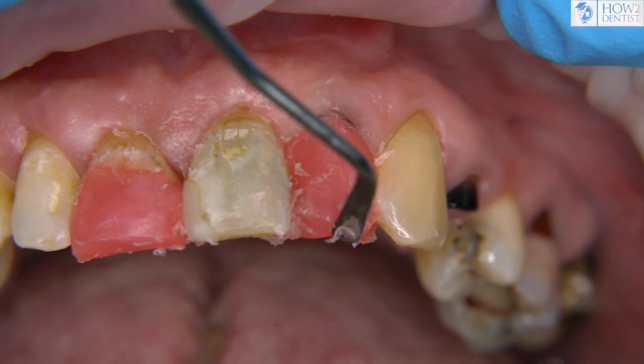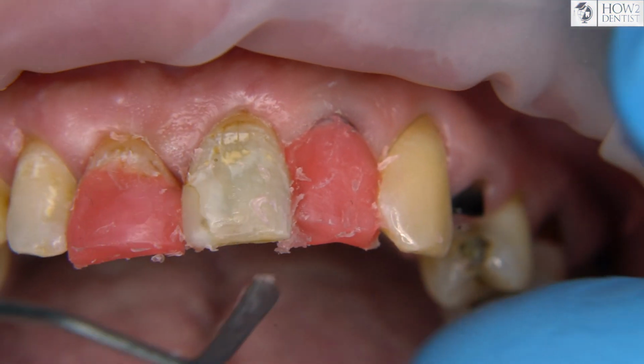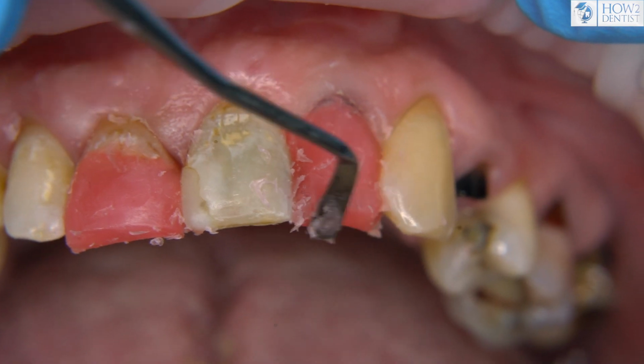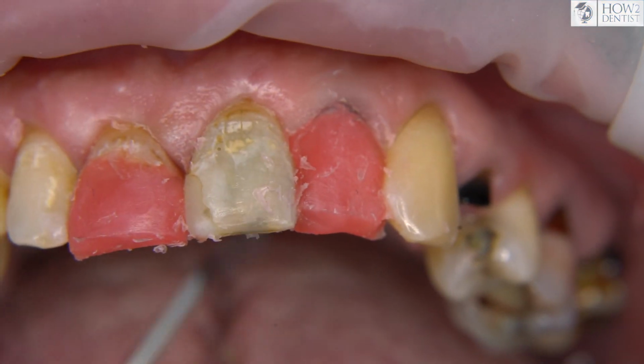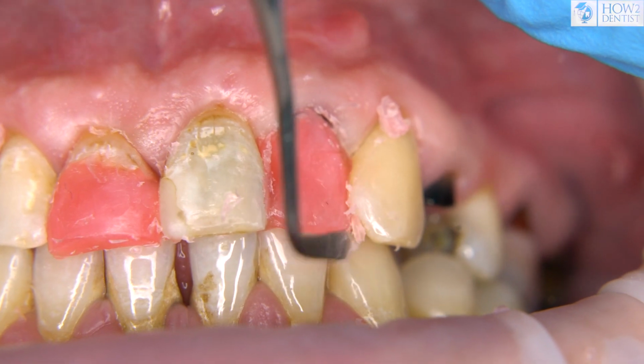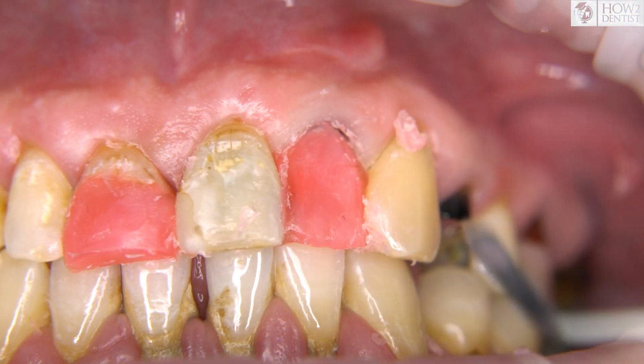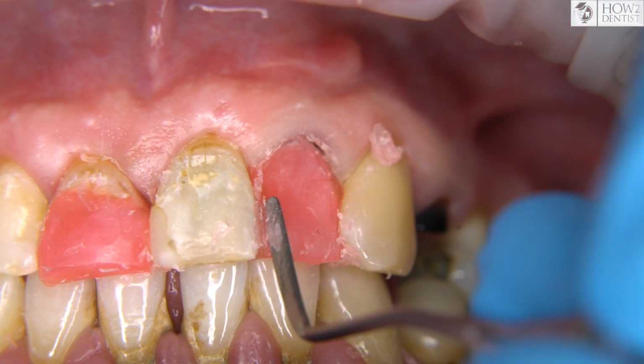The wax does not polymerize under the lamp and is easier to correct. While the wax is warm, it's sufficiently plastic. We can give the future restoration the necessary contours. In addition, the patient should be asked to close his teeth, so that later there are fewer corrections to the occlusal contact, and it will help in the formation of the oral surface.